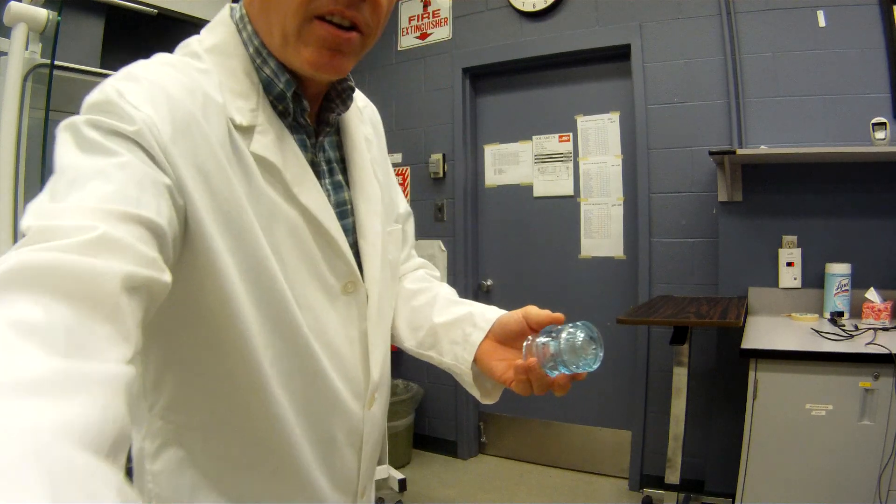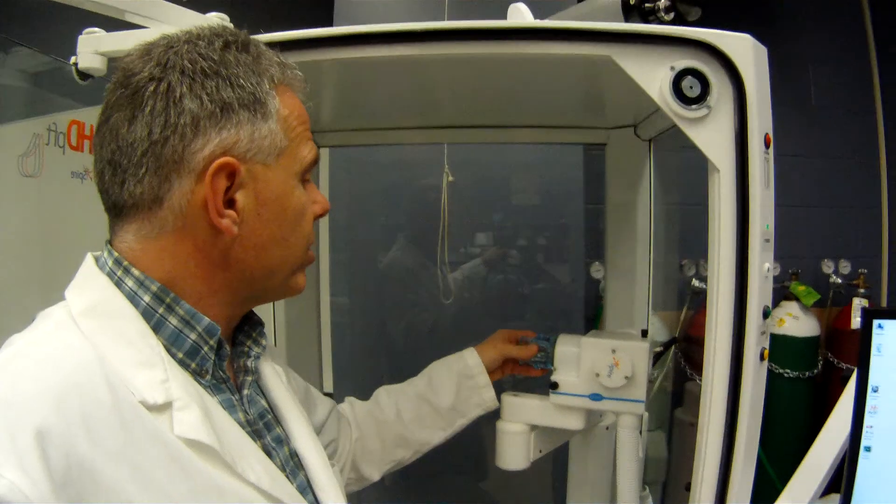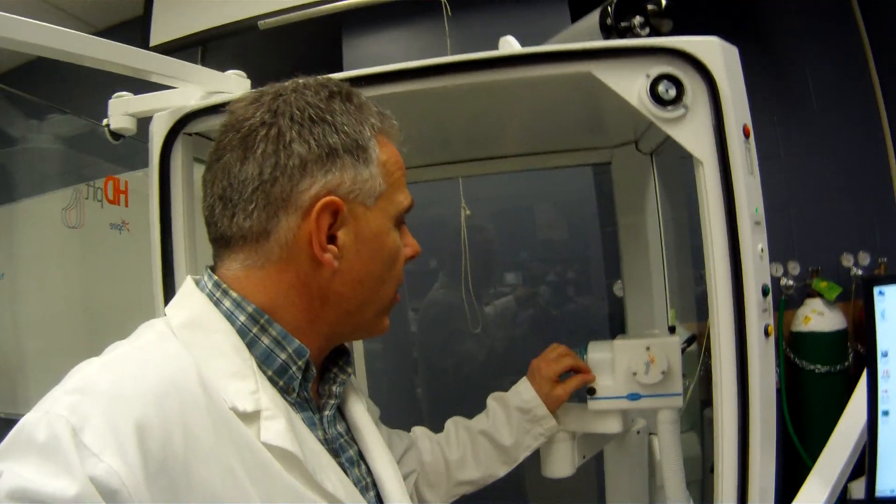This little plastic piece here just fits right inside, and the actual connectors to the pneumotach go down into the computer, and the pressure transducers are down here just housed in this unit right here.